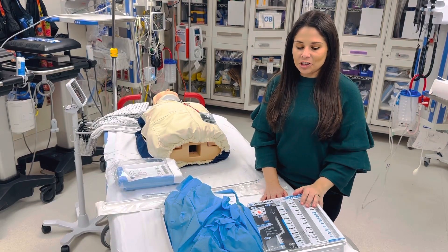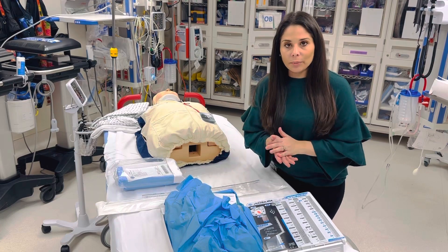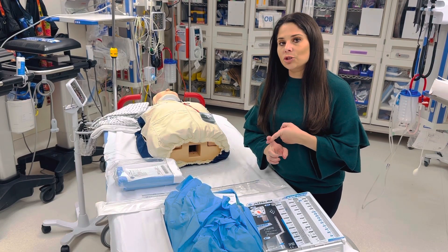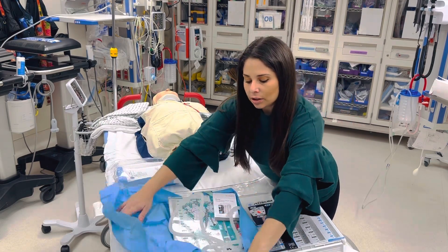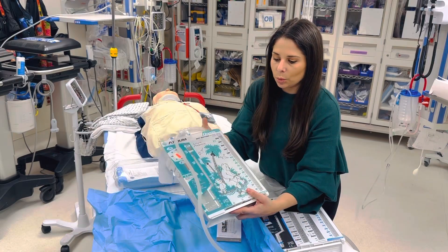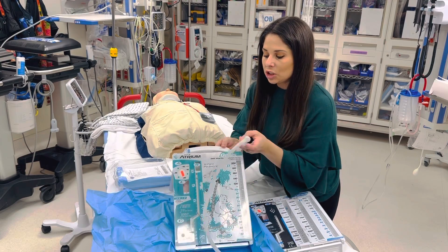Hey everyone, I'm Jordan with Trauma. I'm going to talk to you guys about chest tubes. Just a quick reminder, there are two different types that may be stocked on your unit: the dry seal and the water seal. The water seal is also known as your Oasis. This is a pediatric one — the adults are the same, they just don't have all of this cuteness on them.